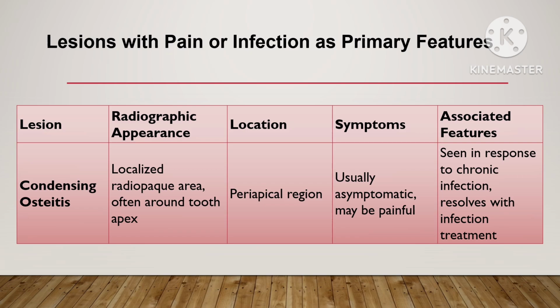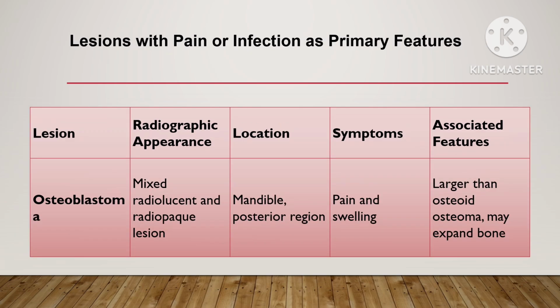So this was all about lytic and sclerotic lesions on the radiograph.